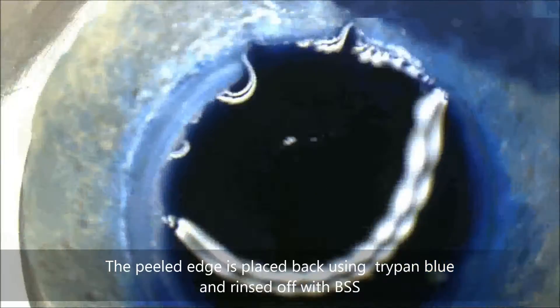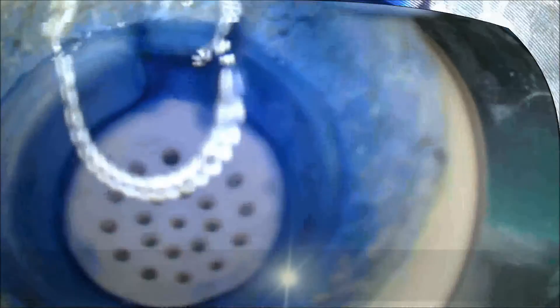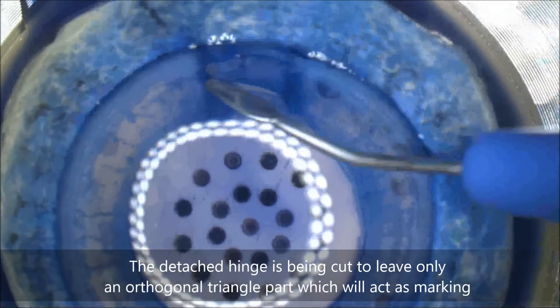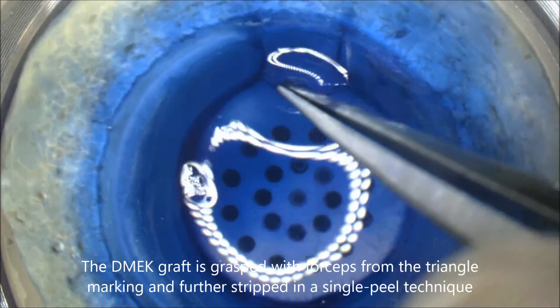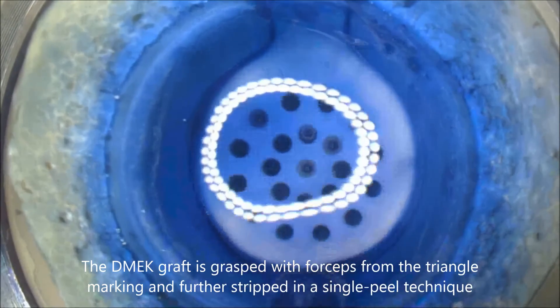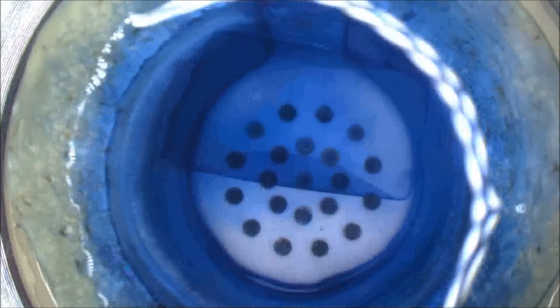The peeled edge is then placed back using trypan blue and rinsed off with BSS. The detached hinge is cut to leave only an orthogonal triangle, which will act as marking. Then the DMEK graft is grasped with forceps from this triangle and further stripped in a single peel technique until it forms a double roll.